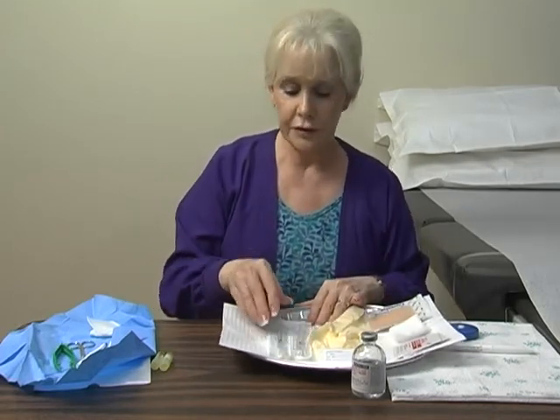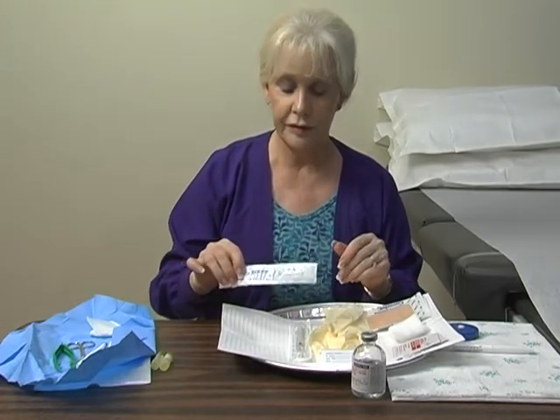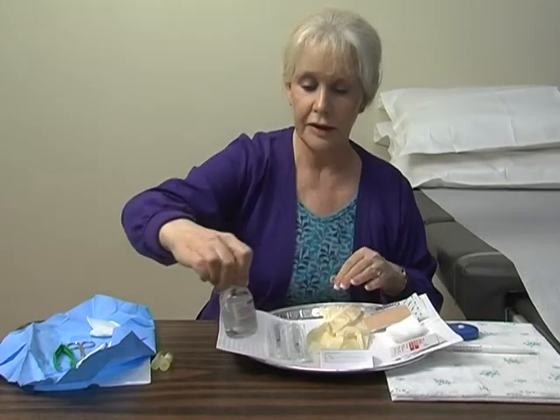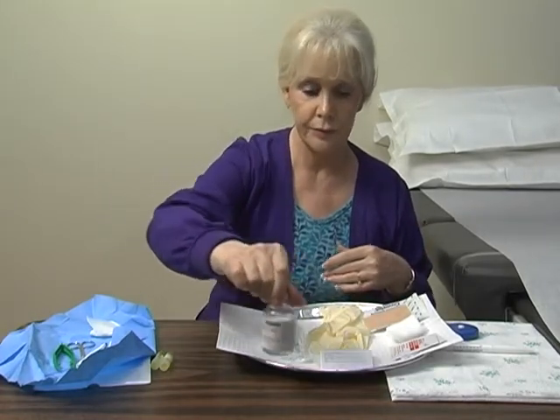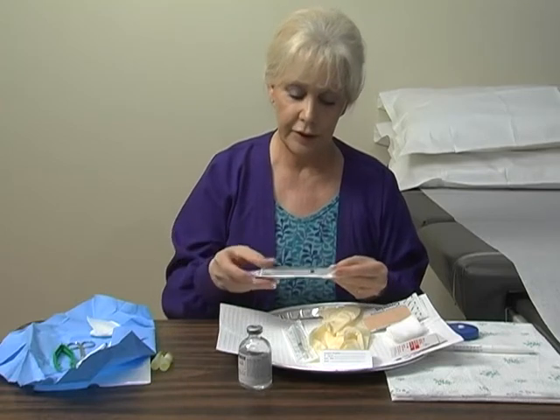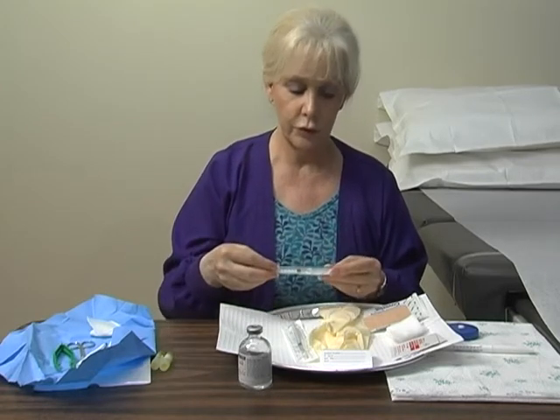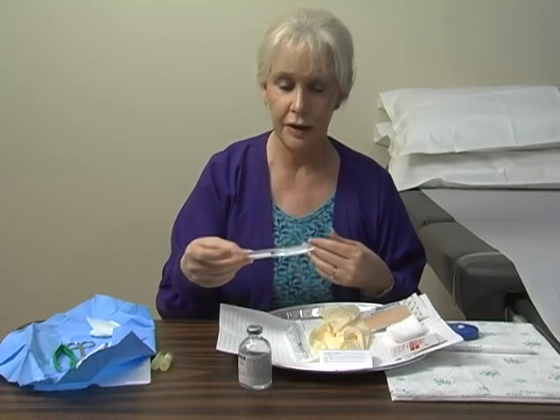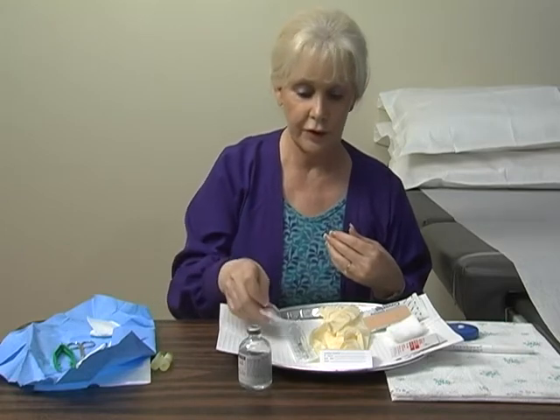As far as additional supplies, you'll need TB syringes — 1 cc with a 27-gauge needle, half inch or smaller. You'll also need lidocaine with epinephrine; we use the 1 to 100,000 concentration. I typically draw up about 0.7 cc of lidocaine. For good anesthesia at the site, 0.4 to 0.5 cc is usually sufficient. However, if with the needle test they still feel sensation, you've already got extra fluid there. Also, because you are going so close to the surface of the skin, there is a tendency to go in with the needle and back out the other side and lose a little — that way you can pull back and still have enough within the needle.